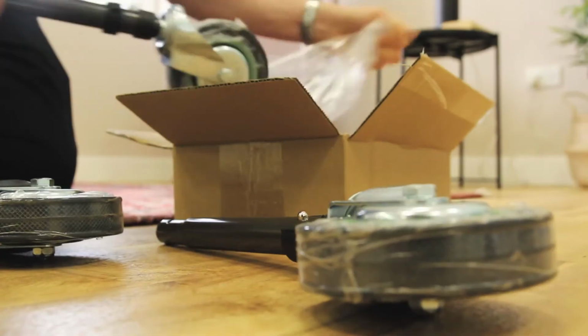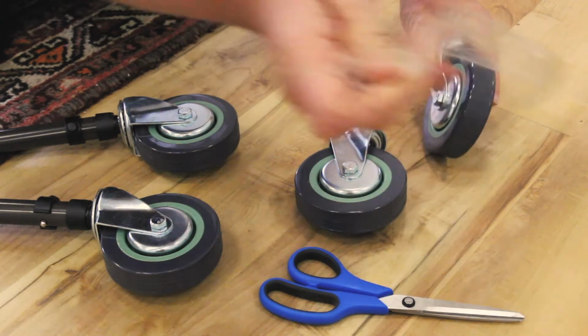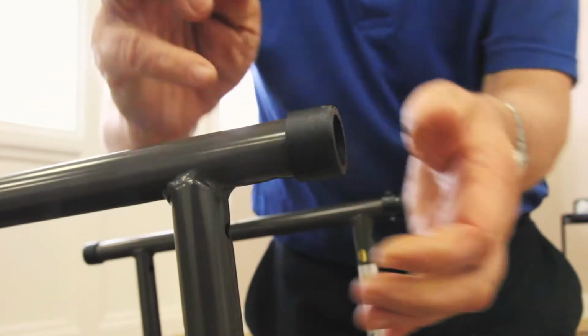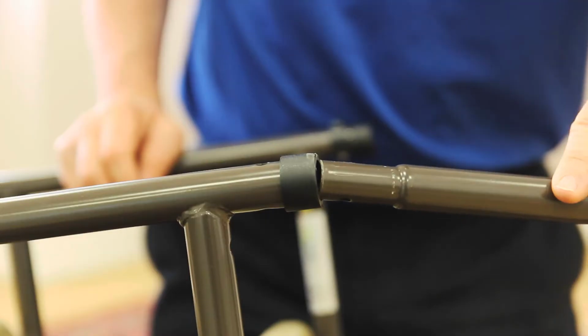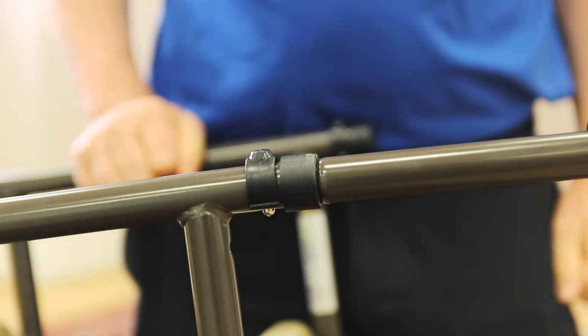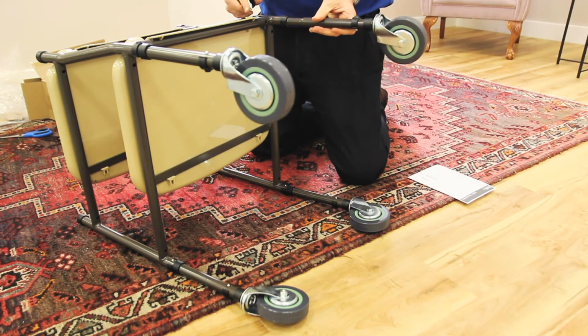You can now unbox and unwrap the caster wheels. Tilt the frame on its side and remove the push pins. You can now insert the caster wheels. Reinsert the pin to secure the wheel into the frame, repeating this process for the remaining wheels.